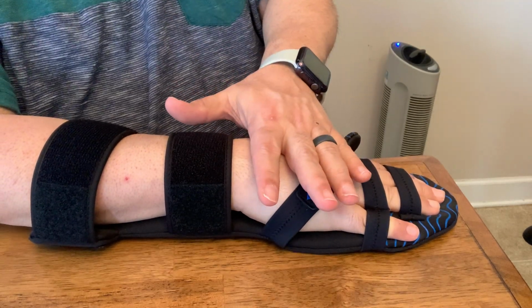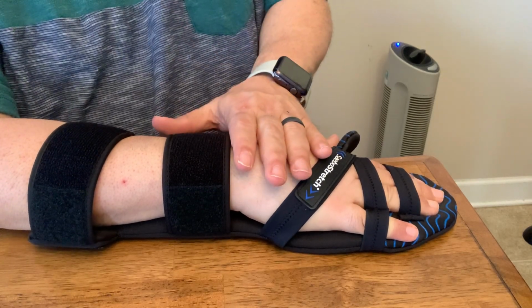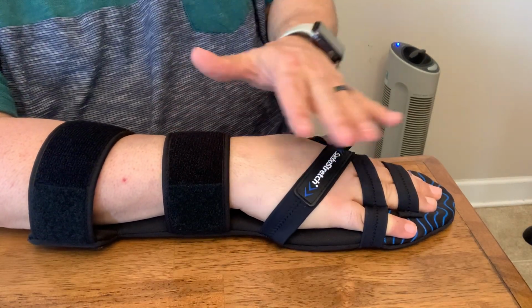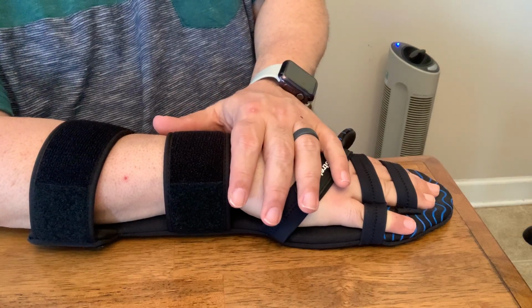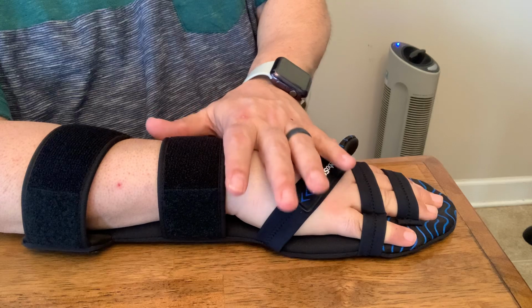I love you guys, and this is still being worn. I'm at 6 hours a day. You kind of work your way up. The longer you keep this on, the better it is. The more your hand forms to a straight position. It's always good. So when it's relaxed, it'll be in a straight position.